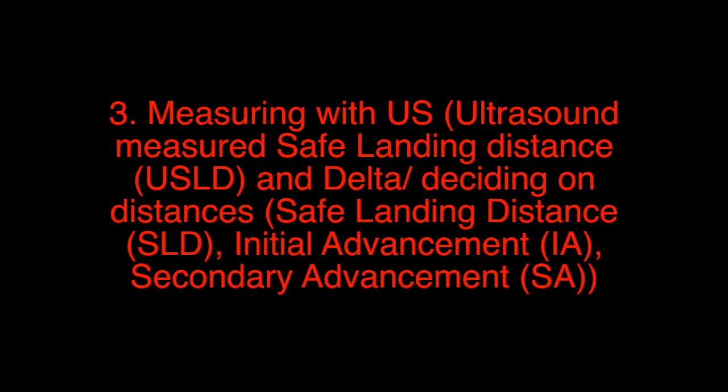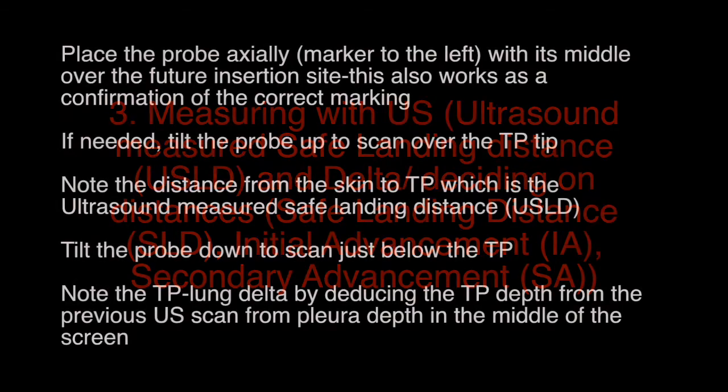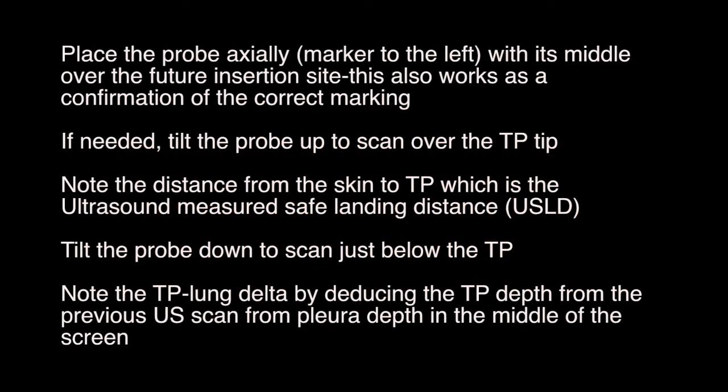Step 3: Measuring with ultrasound and deciding on distances. Place the probe axially with the marker to the left, with its middle over the future insertion site — this also serves as a confirmation of correct marking. If needed, tilt the probe up to scan over the TP tip and note the distance from the skin to the TP, which is the ultrasound-measured safe landing distance. Tilt the probe down to scan just below the TP, and note the TP lung delta by deducting the TP depth from the pleura depth in the middle of the screen.